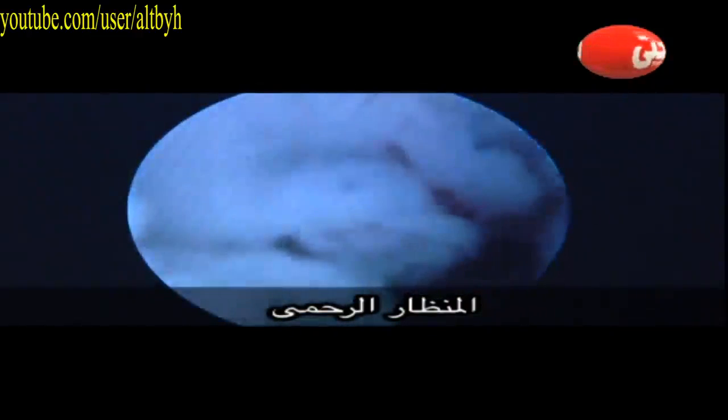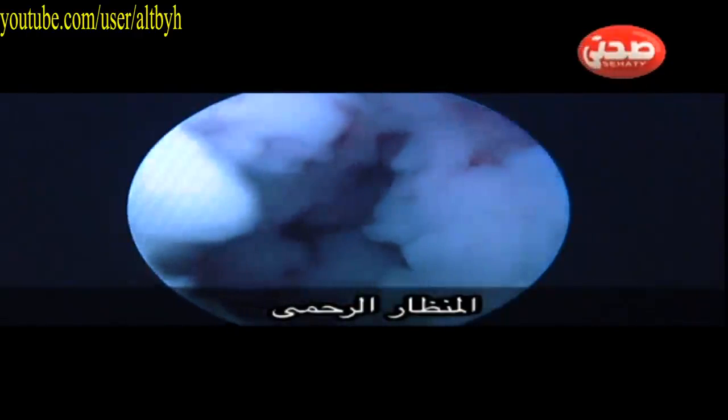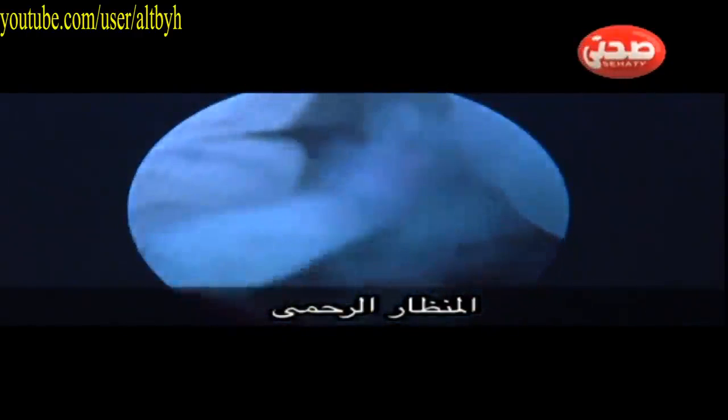This is another example of endometrial cancer, also diagnosed after high suspicion on ultrasound and confirmed by biopsy.